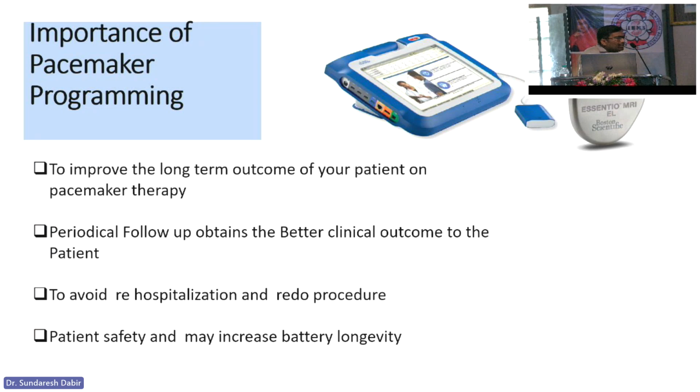And also the critical part is that it can go into loss of capture, over sensing. There are a lot of things which we are going to discuss further. That is going to be about patient safety.